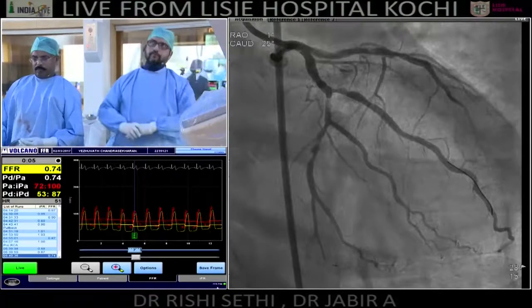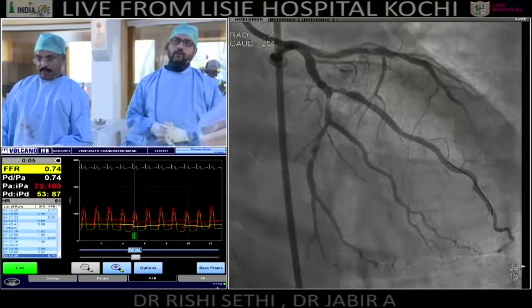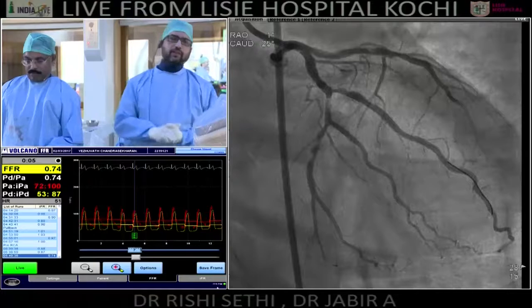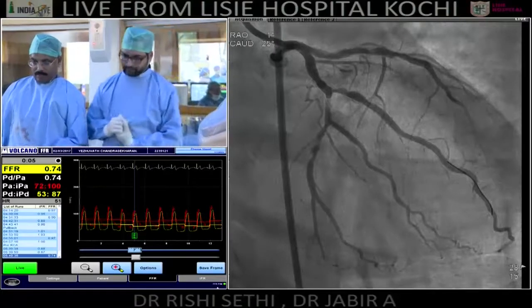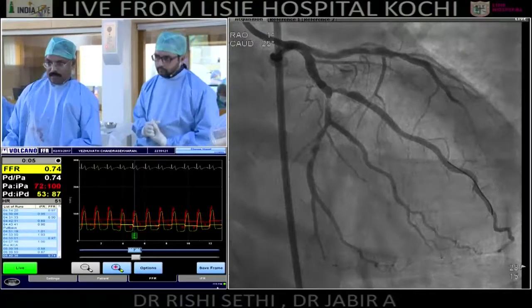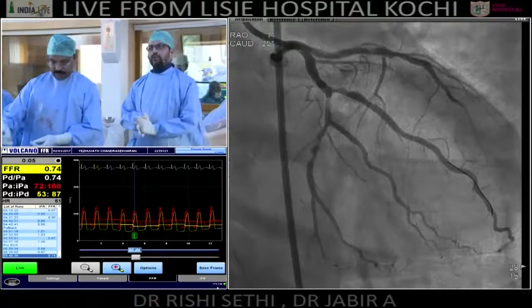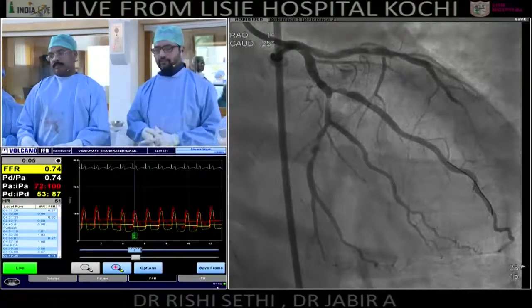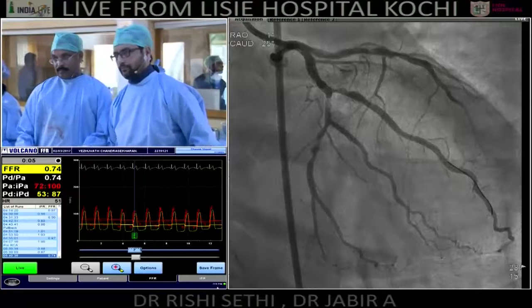Yeah, right. And now we did an FFR after how much time? I mean, we vasodilated this artery again? We vasodilated, we did an IFR and an FFR on the distal circumflex, and that was significant. So why do you think that the IFR is negative and the FFR positive? The IFR is not negative. Both were positive. IFR is 0.89 and 0.88 or 0.87. Both are positive. For that lesion, IFR was not negative. Distal circ. So then there is no problem in just going and doing the intervention, right?